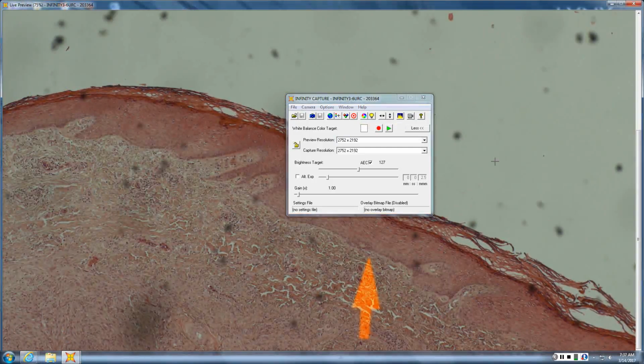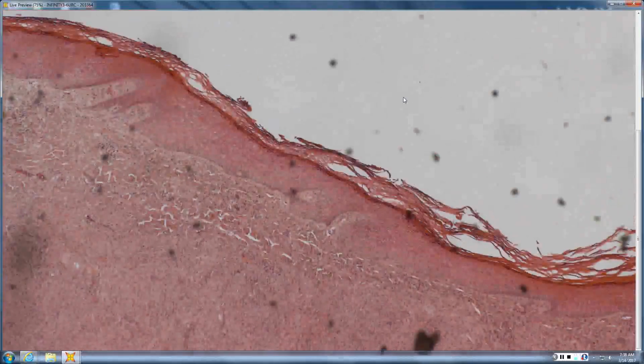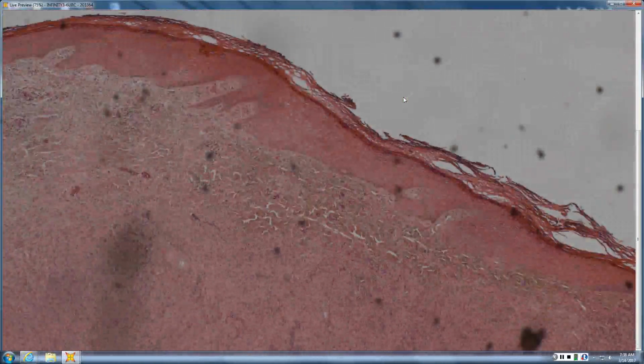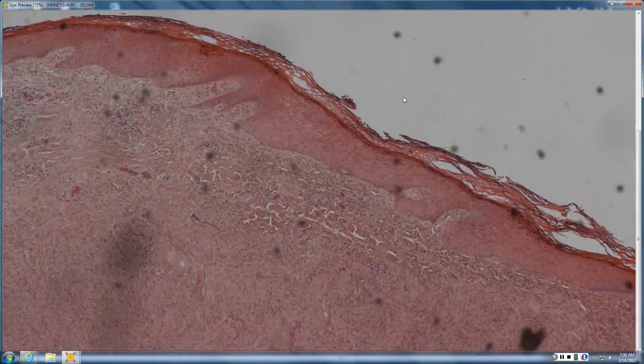On the other side, that looks more effaced and looks like it's destroying the DJ more than the other cut that's mirroring it. But using clues that are on the slide, most big things efface the epidermis. This has acanthosis. So what kind of fibrous tumor do you know of that does acanthosis?